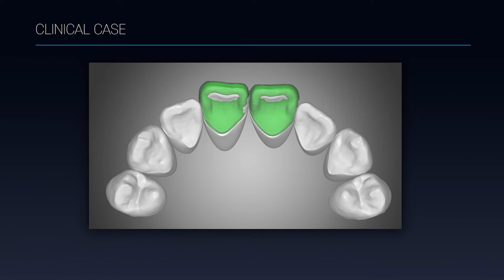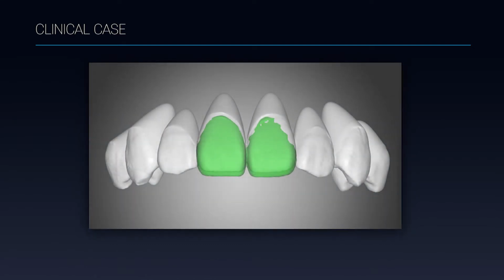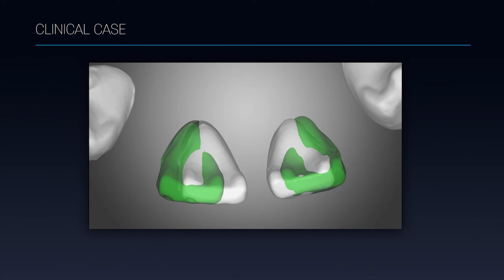Considering the distance and direction of movement of the tooth, it divides the steps to meet the device mounting jointness and setup efficiency. In the case of tooth intrusion or extrusion, the vertical movement value when viewed from the occlusal surface is large, so the movement distance should be set higher. If additional tools, such as elastic, etc., are used, the moving distance should be small. Movement distance means not only translational and bodily movement, but also rotational oblique movement.